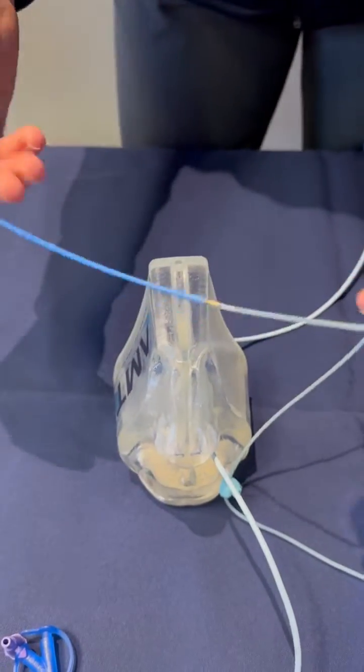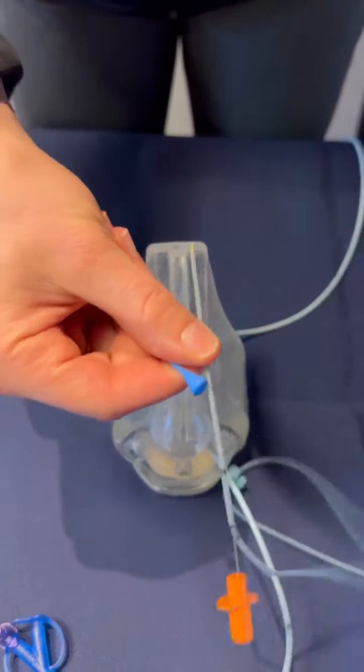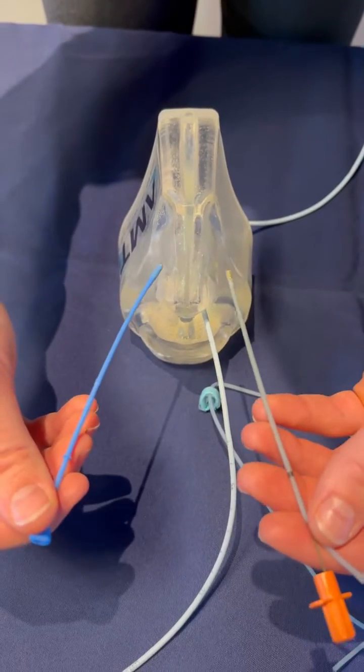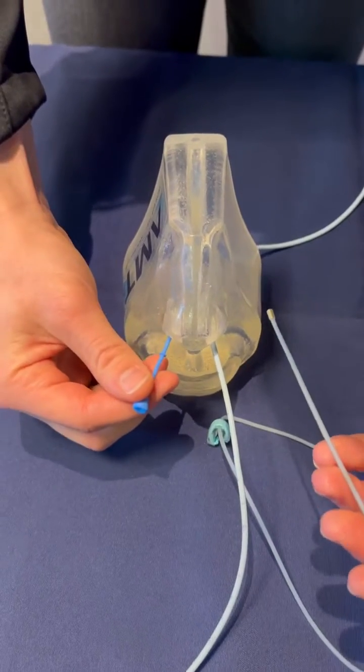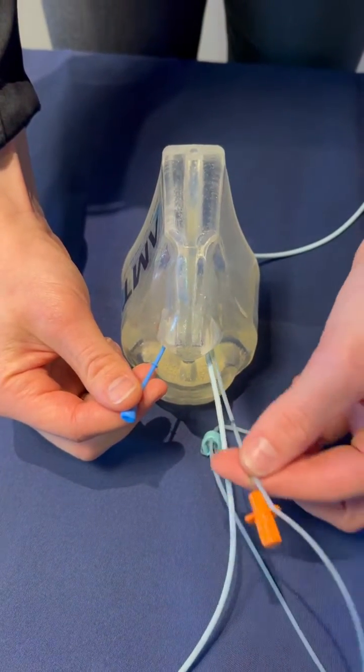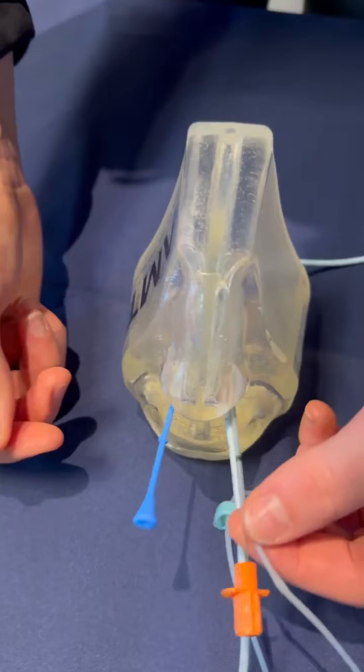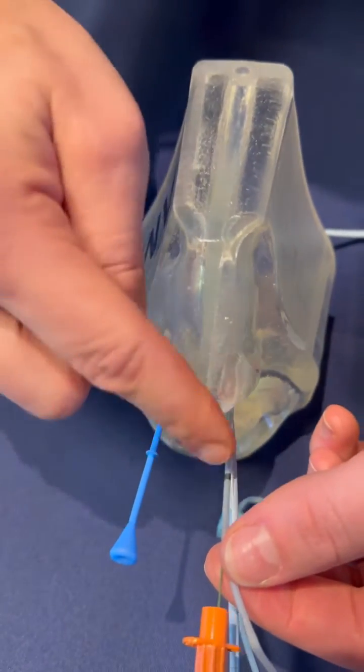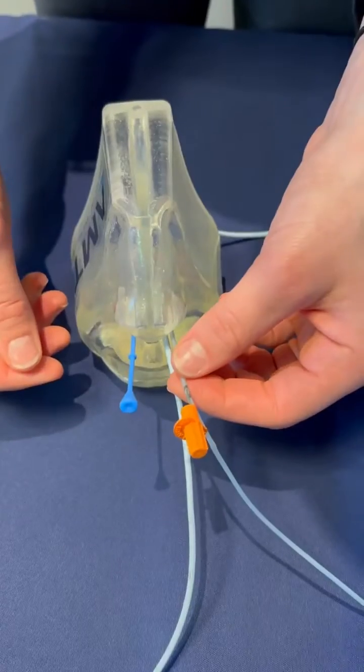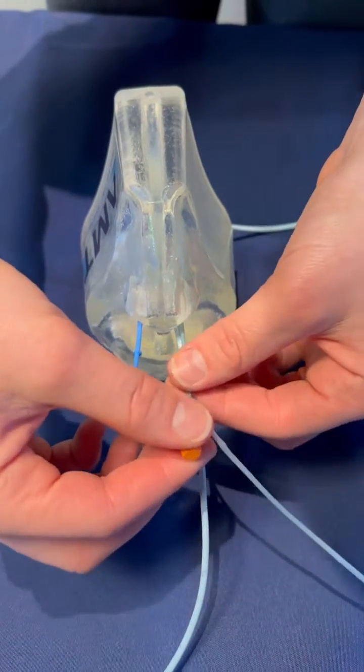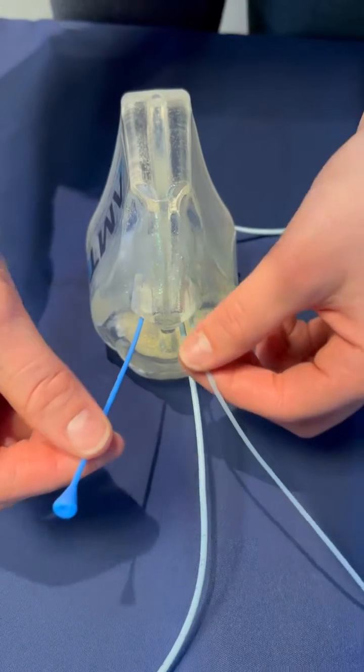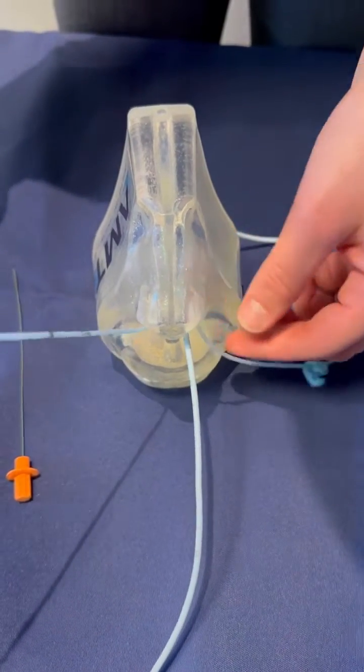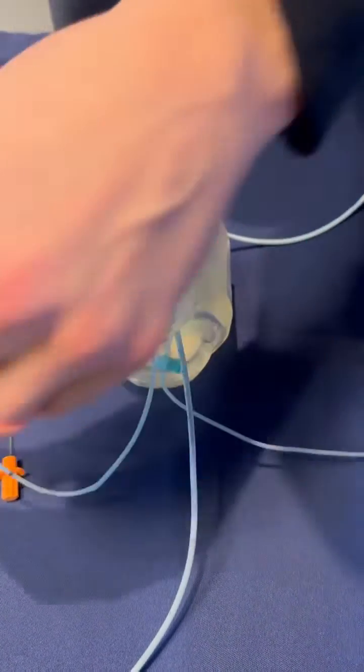Let's show you how you'd insert this to keep your tubes secure. Usually we're going to insert one side on one nostril first. It's got a magnet on the end of it, and then the second device is going to go in and you insert it up to those black marks. Once the magnets have connected in the back, you're going to pull out the stylet and then grab the blue side and kind of pull the fastener around the back side of the nose.